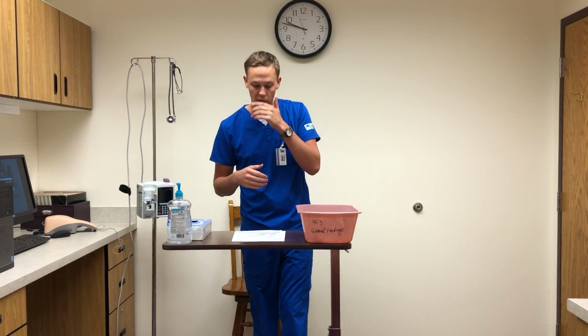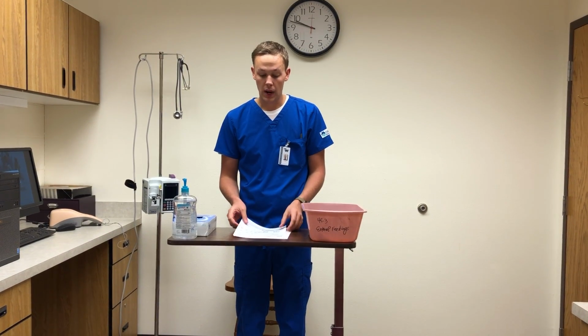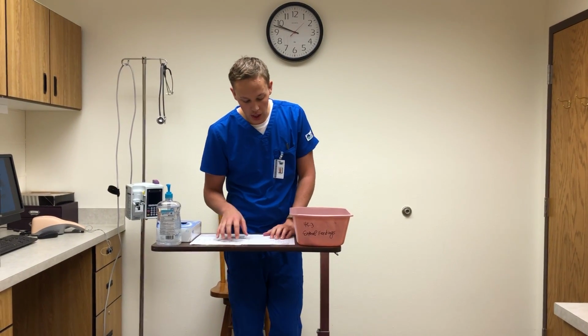I'm a student nurse at Wilson State College, and today I'm going to be performing a skills video of mixing insulins, drawing insulins, and administering them via a syringe and a pen. So the first thing that I'm going to do is compare my MAR with my provider orders. So I will be beginning with that.